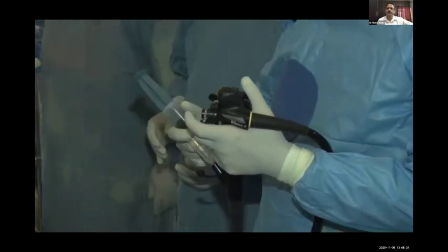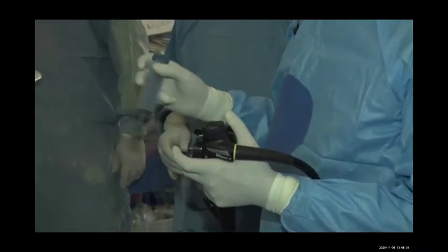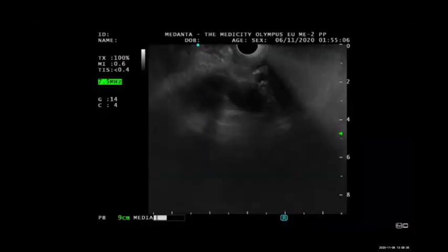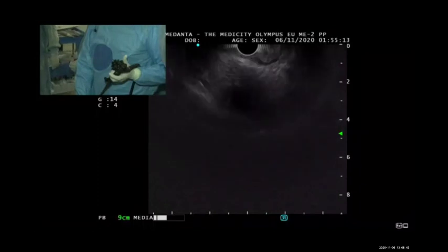Yes, you are audible. Any question you can ask in between, because I am going to demonstrate one case in the length and we will discuss about this case. So the most important thing is, many of the time you have seen I am going to focus the varix. Just give me a minute. This is the aorta.